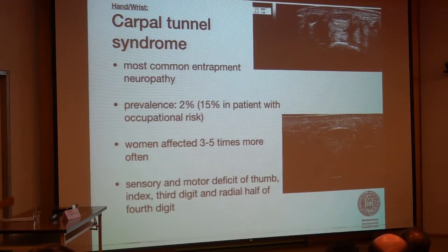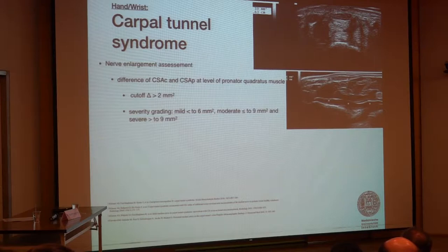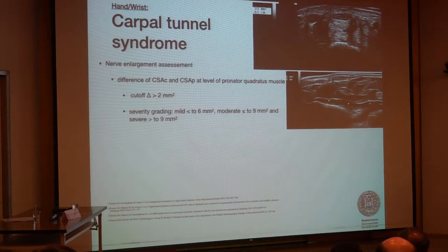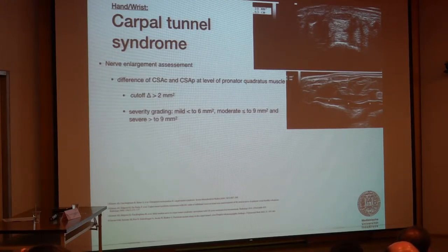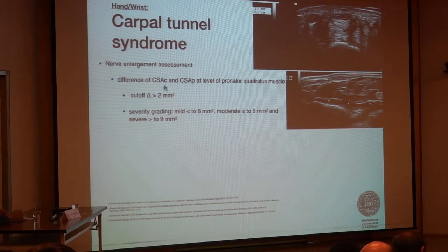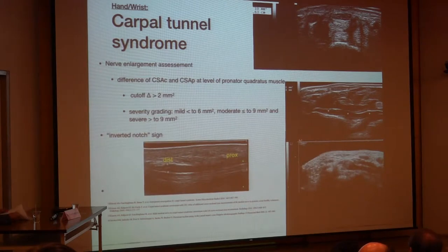Here is a cross-sectional area measurement obtained in the carpal tunnel. What is very helpful is to do a comparison to a more proximally located measurement. We can use an anatomical landmark, which is the pronator quadratus muscle. We then make a difference between the most enlarged cross-sectional area in the carpal tunnel compared to the proximal measurement. There is a cutoff of 2 or 2.5 mm², which has been shown to be very helpful in the diagnosis of CTS.